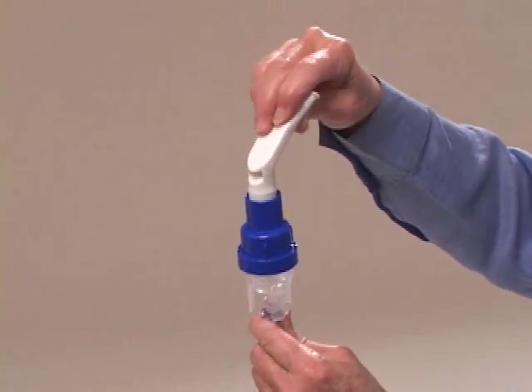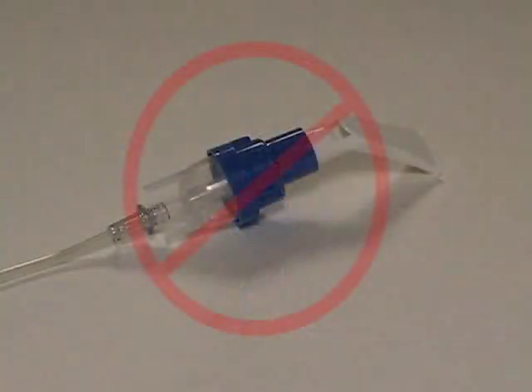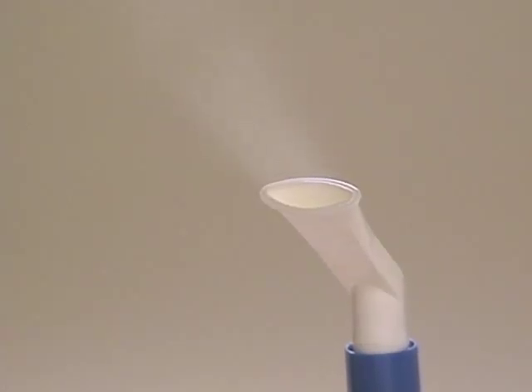Attach the mouthpiece to the top of the medicine cup. Do not lay the Sidestream on its side, as this will cause the medicine to spill out. Begin your treatment by turning on the compressor. The nebulizer will create a fine mist.